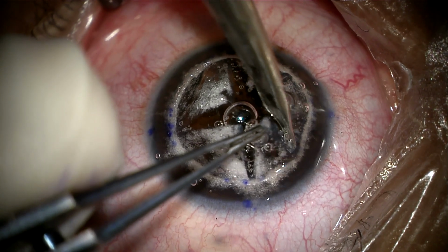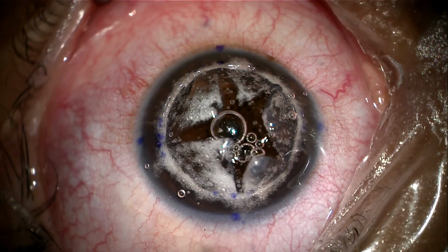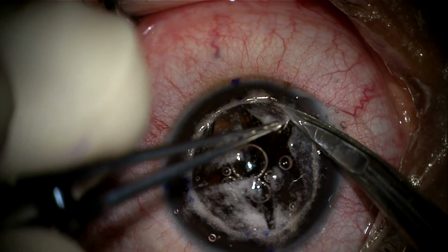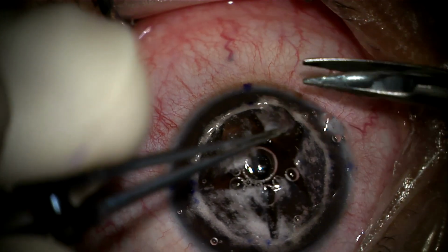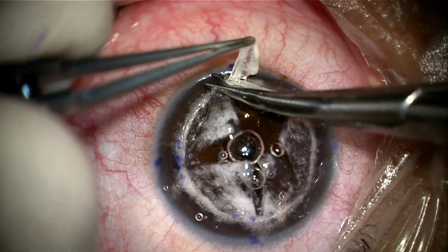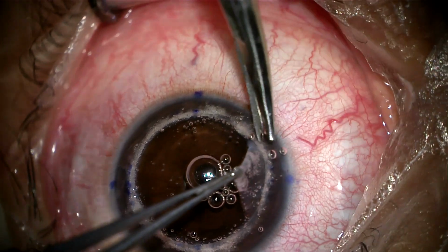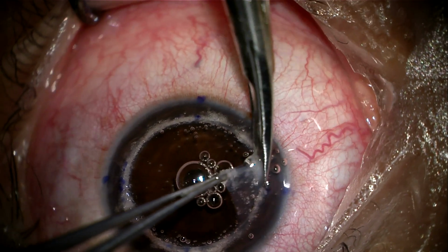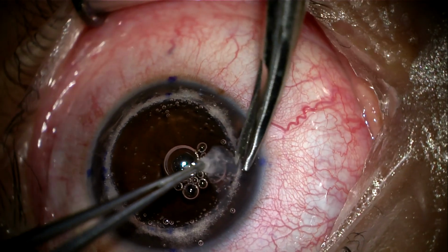Each quadrant is then cut by grasping the quadrant with a toothed forceps, pulling it towards the center, then introducing the scissors, turning the blades of the scissors vertically and pushing against the graft-host junction, followed by closing the blade and cutting the quadrant, thus ensuring a smooth graft-host junction without stromal ledges. Cutting of each quadrant should also be in snips and avoid continuous cuts to avoid entangling Descemet membrane in the tip of the scissors.